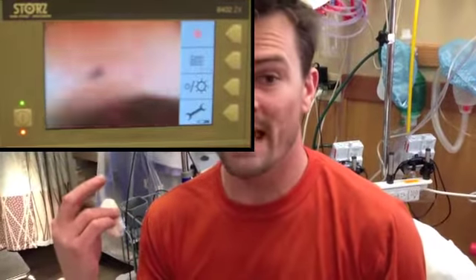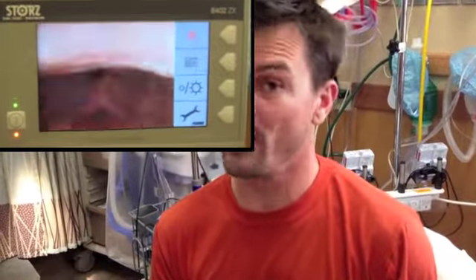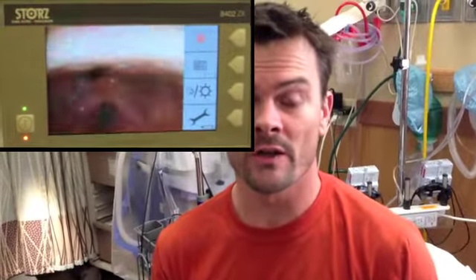At that stage, when you have the endoscope right over the cords and you know you're going to go in there, I would have already given the patient some ketamine, 25 to 50 milligrams for an adult, and they would already be sort of dissociated or sub-dissociated. That's really helpful in this setting, and it takes away all the discomfort that I just went through, which was minimal.